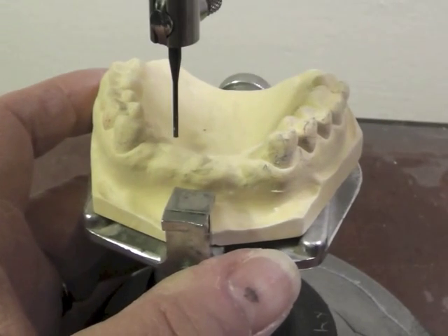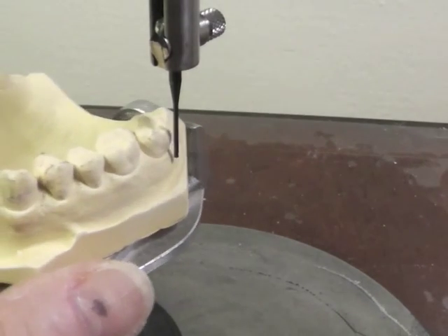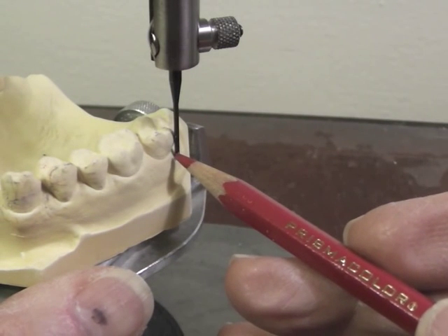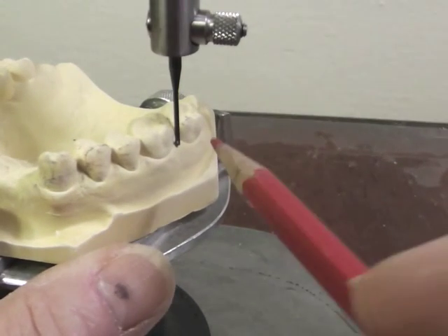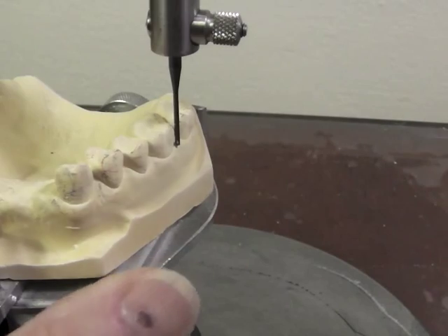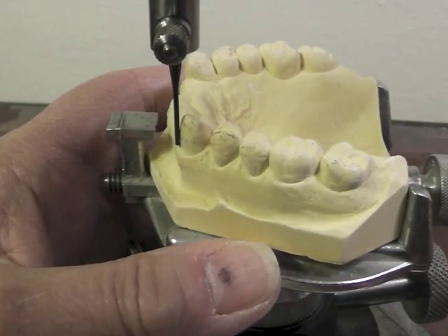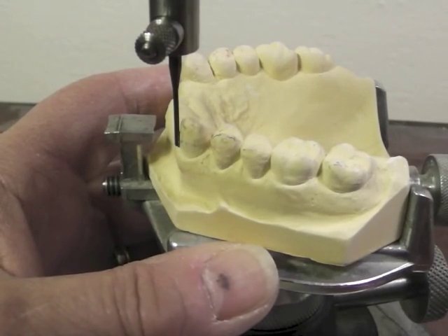Now let's look and see whether we have undercuts. When we put this analyzing rod up against the tooth, you can see a triangular space of light indicating an undercut on the distal buccal of this molar. I have a slight one on this molar here as well. Looking at this canine, I don't have much of an undercut — it kind of leans to the distal. I might have more on the mesial, but not much on the mesial facial.